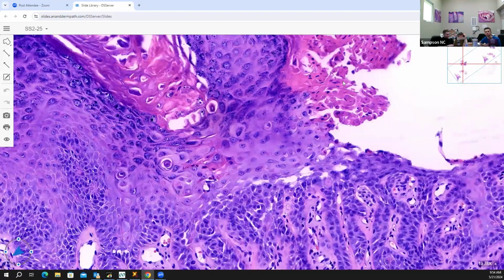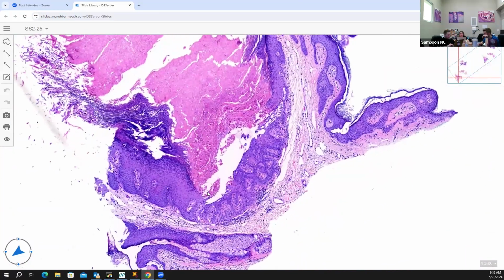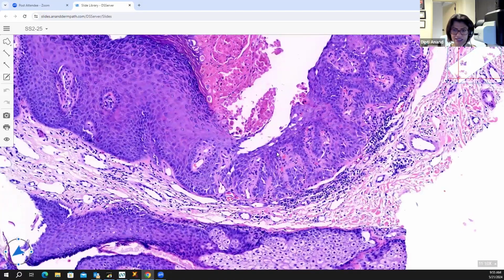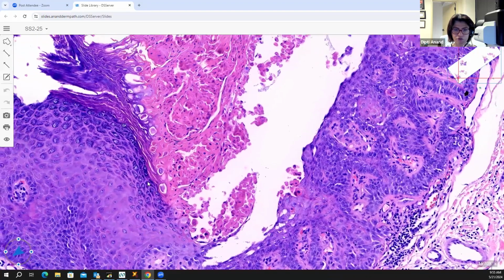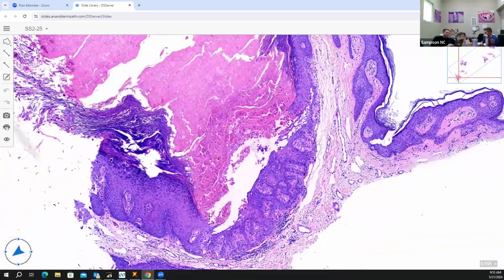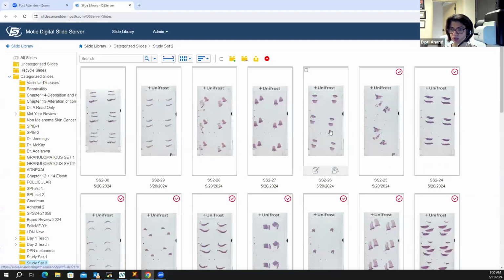Oh, okay. So it's like a warty dyskeratoma? This is a warty dyskeratoma, and they will have an acantholytic squamous cell carcinoma in your differential. But this is very well circumscribed. You see that? And the surrounding epi is completely normal. Wherever you're seeing the corps ronds and corps grains is where you see some reactive atypia to the epidermal keratinocytes. But everybody recognizes the beautiful corps ronds and corps grains? So this is a warty dyskeratoma. Gotcha. Okay. The next one is 26.